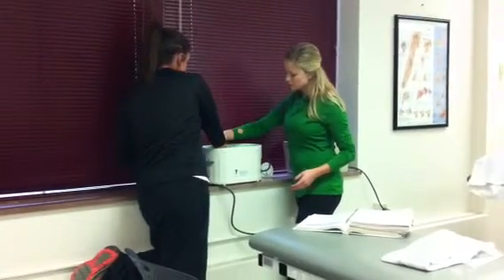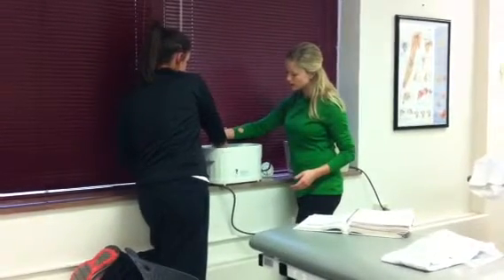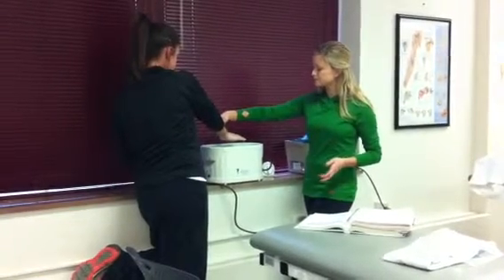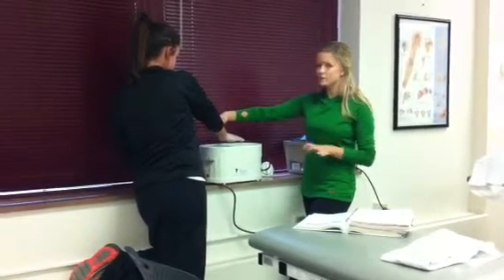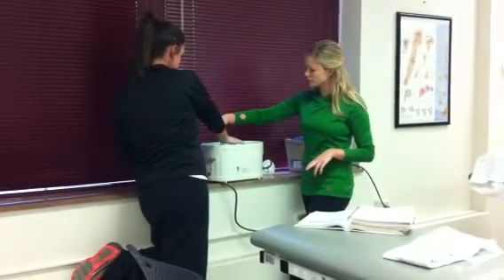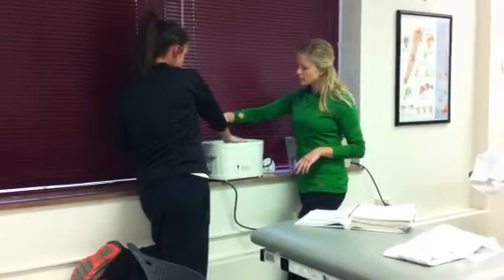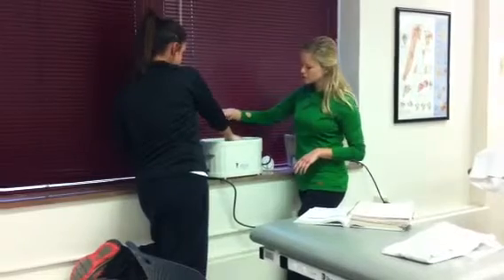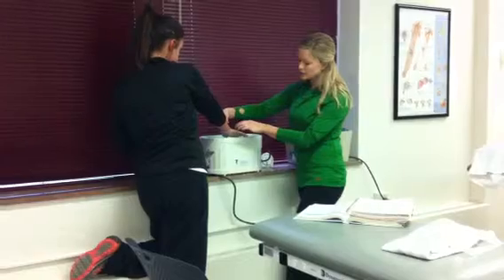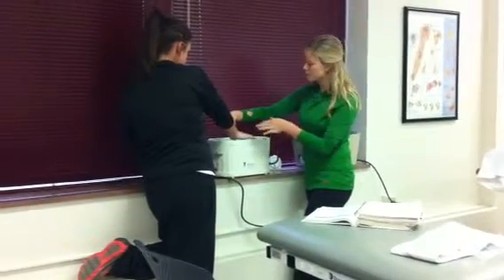Then she would dip it back in and leave it for 20 minutes, but we're not going to do that. The other method, she would just do the same thing but dip it six times. We've done it twice, so we'll do a few more and say we did six. Each time you dip on this method, you want to make sure that you don't go as far as the time before, because if you do, the hot wax can get in underneath the layer and burn your patient.